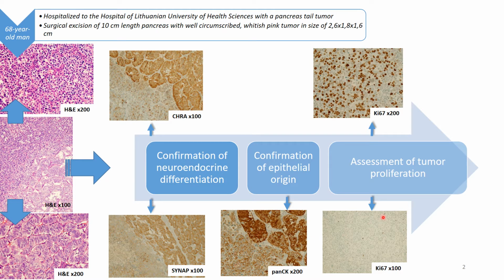tumor components. Assessment of tumor proliferation is checked by the Ki-67 proliferation index, and the Ki-67 reveals different activity in these two tumor components. In the well-differentiated part, it was just up to 1%, and in the poorly differentiated part, it was very high, about 85% in hot spots. So our diagnosis was pancreas well-differentiated neuroendocrine tumor with a component of poorly differentiated neuroendocrine carcinoma. Such a combination was quite strange and uncommonly seen.